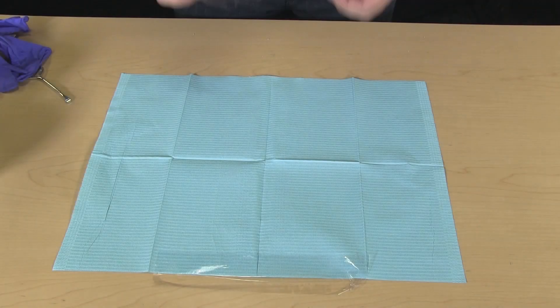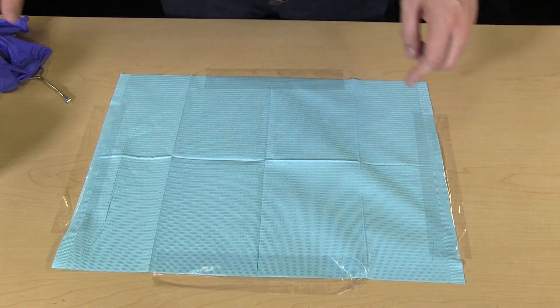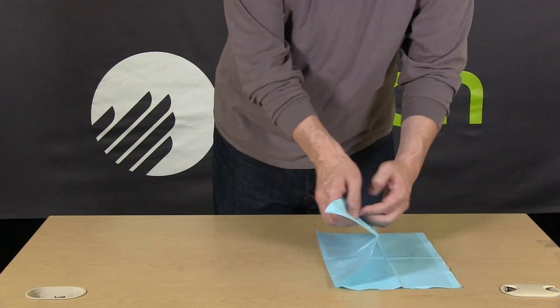On a clean flat surface, tape down the work mat. An unsecured work mat will make it difficult to use impression material later on.